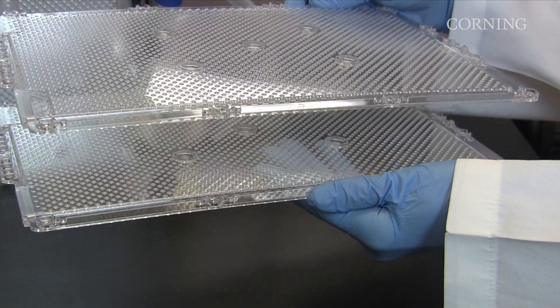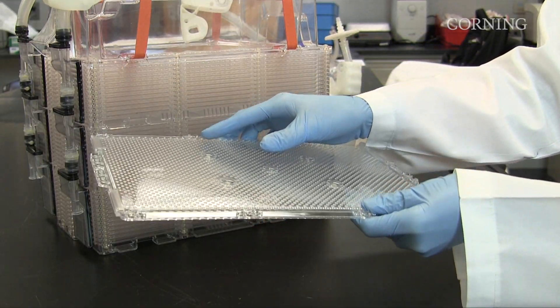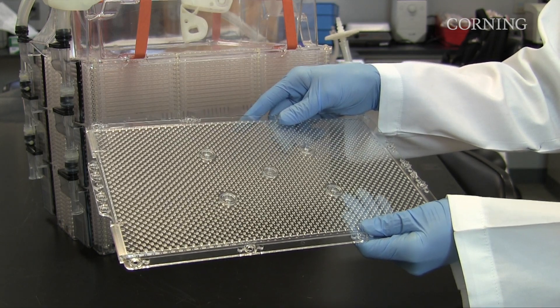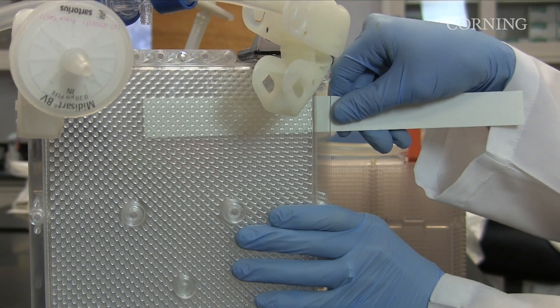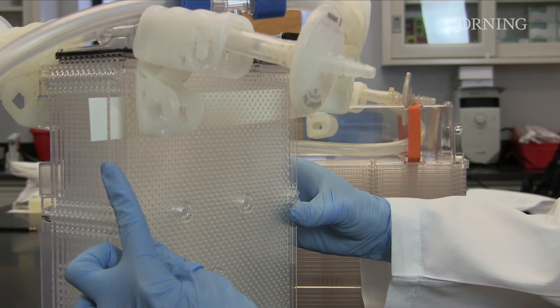The stackette is the individual cell culture chamber. It is comprised of a top plate and gas permeable film. Each stackette has a total of 500 square centimeters of growth area. The tracheal space is an open air space between each stackette layer that allows gas exchange to occur through the gas permeable film.